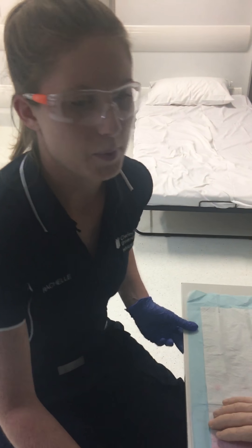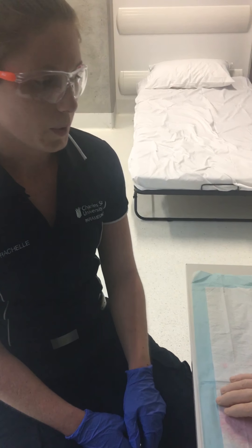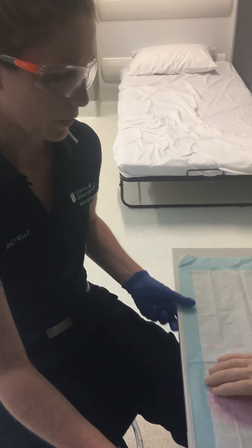Alright, hi everyone. Today what we're going to be doing is just working through how to do cannulation. I'm going to work step by step through it so you can follow along.